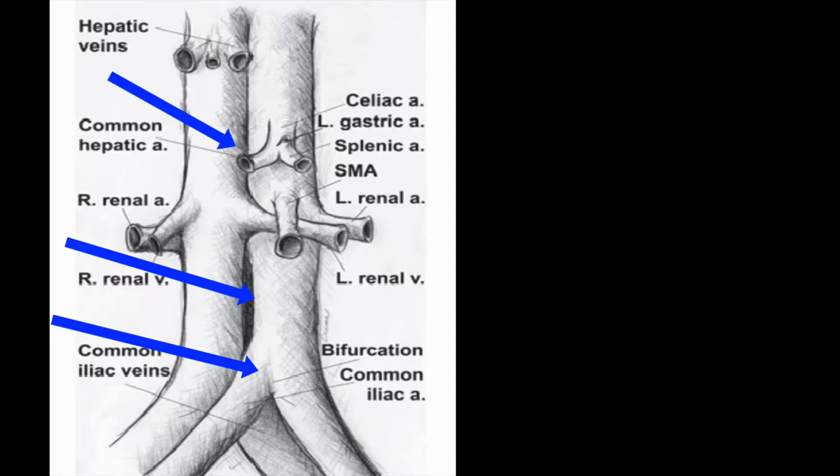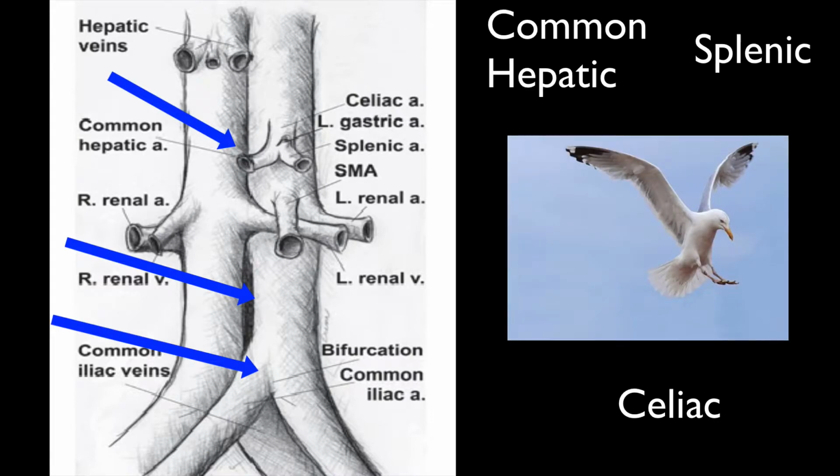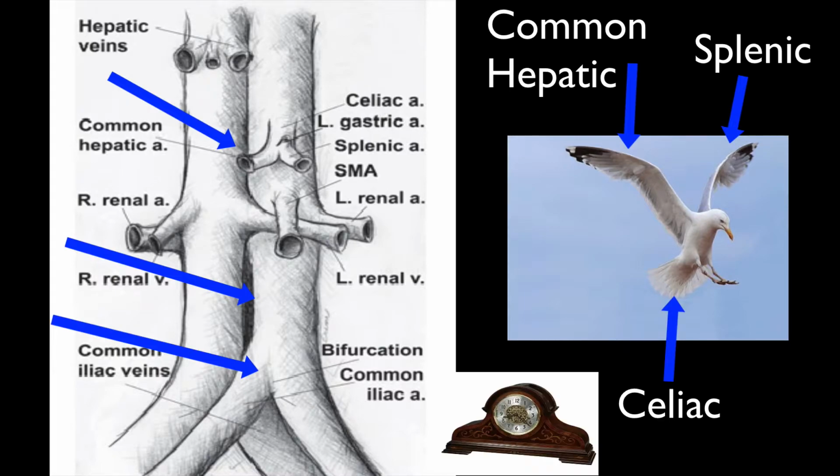You start in the subxiphoid of the patient, which corresponds to the proximal abdominal aorta. In this area, you'll likely see the celiac trunk, which branches into the common hepatic artery and the splenic artery. Just below that, you'll see the superior mesenteric artery. As you descend down to the mid-aorta, you will measure the diameter there as well. And as you move towards the umbilicus of the patient, you should see the bifurcation of the aorta into the common iliac arteries. In all 3 locations, you should try to measure both in the transverse and the longitudinal planes.